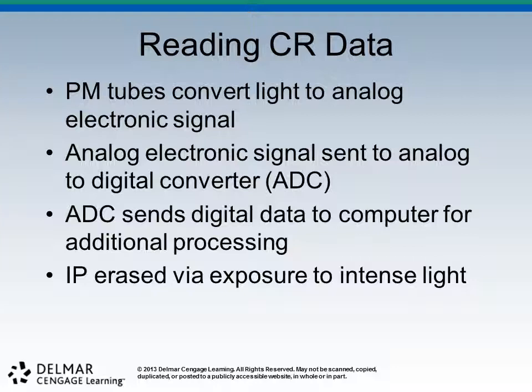Once we've processed this data and get ready to send it off to the computer, the image plate gets a really high exposure of white light, which erases and resets all those electrons and gets it ready to use again.